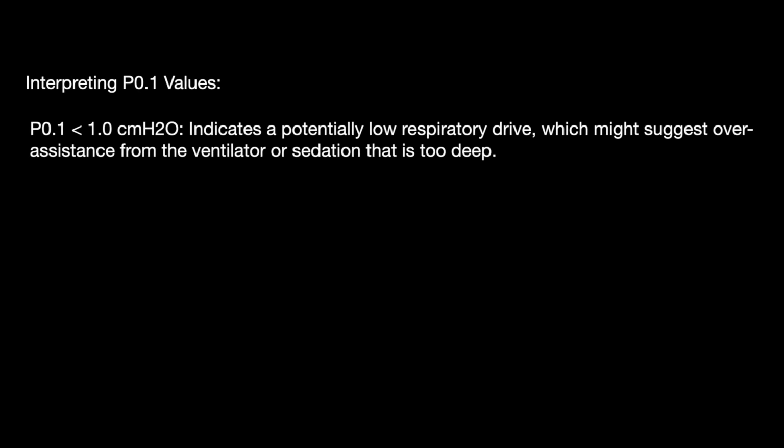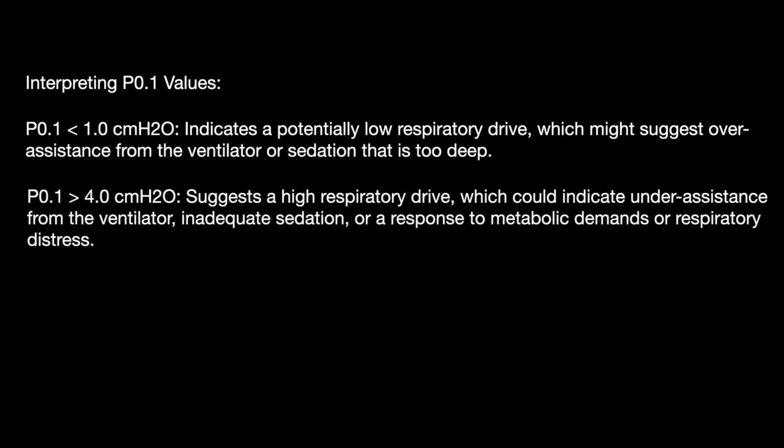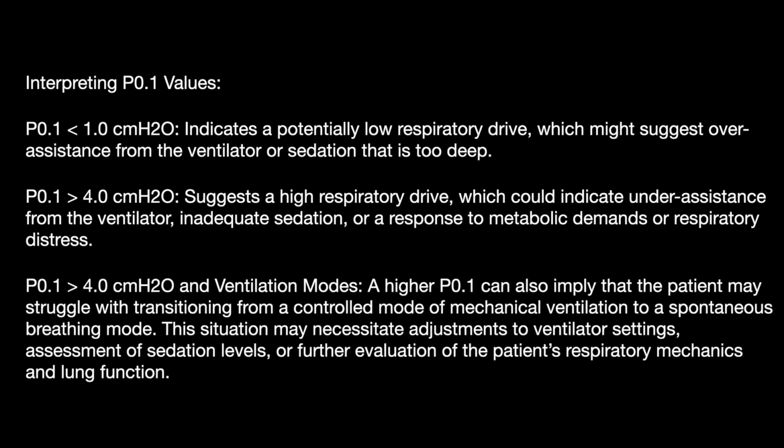Now, what are the interpretations? A value of less than 1 indicates a potentially low respiratory drive, which might suggest over-assistance from the ventilator or sedation that is too deep. A value of more than 4 suggests high respiratory drive, which indicates under-assistance, inadequate sedation, and a response to metabolic demand or respiratory distress.